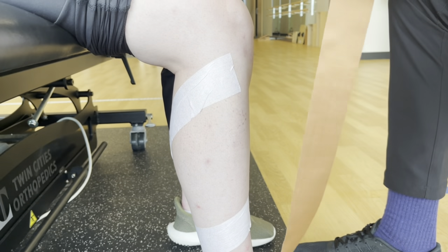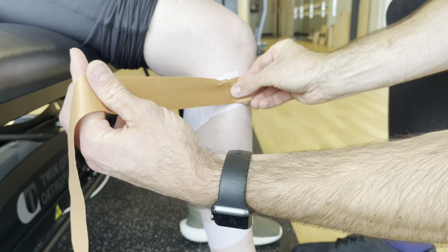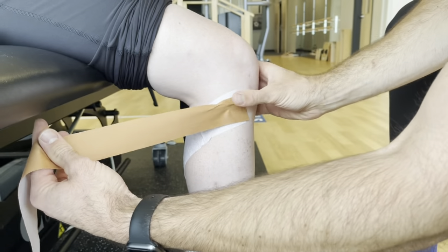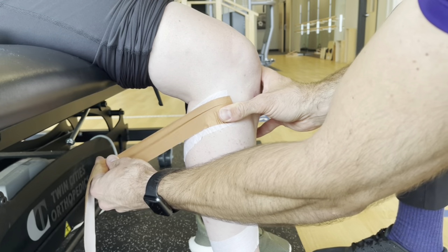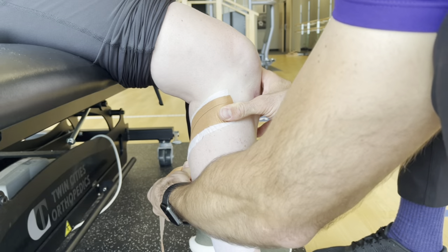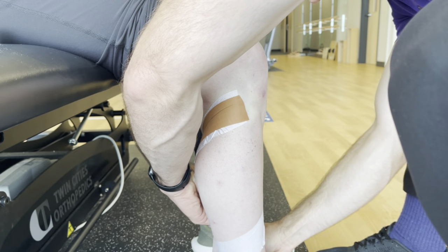Now I come here with my tape. I can stick it on to start. I'm going to find that fibular head there. Now I give it a pull back and put it nice and tight, round on that white.